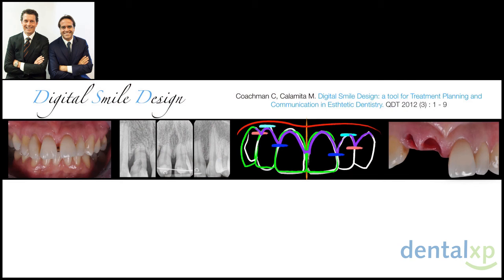Yes, let's also analyze this high smile line patient who presented with a post-orthodontic broken splint in the anterior area. The orthodontic treatment took 5 years. She was worried about increased mobility of the anterior teeth and diastemas, and no parafunction was detected in this case. And in this kind of complicated case, the communication with the patient is key.